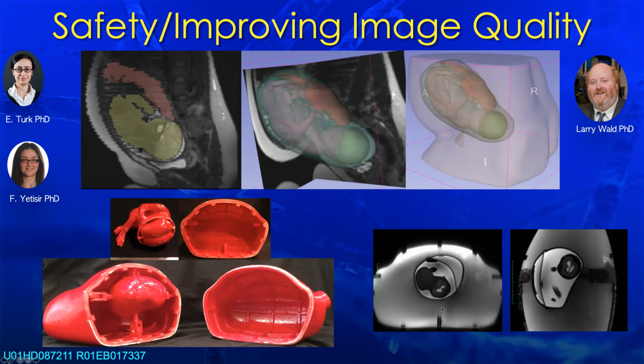It allows us to push the envelope and not have to worry about bringing in mothers for every little single thing we want to tweak or advance, and allows us to really test better the potential impact of our new strategies. We look kind of funny walking down the hall with this thing filled with fluid, and it is quite heavy, but it does really play a nice role in helping us to benchmark new approaches.